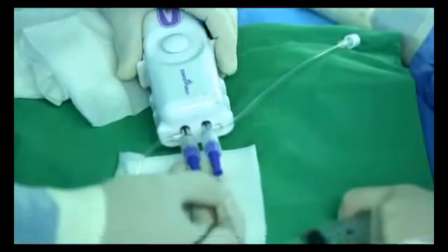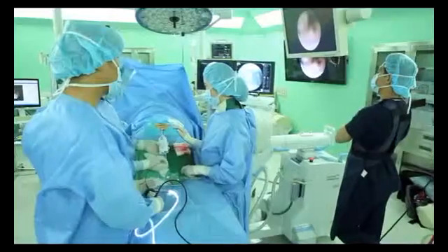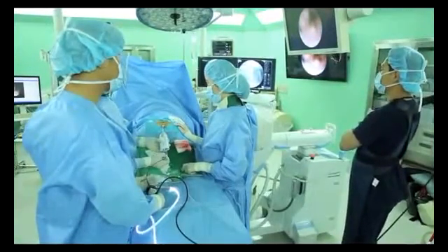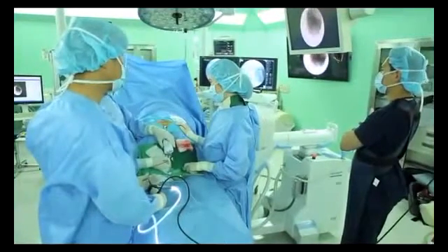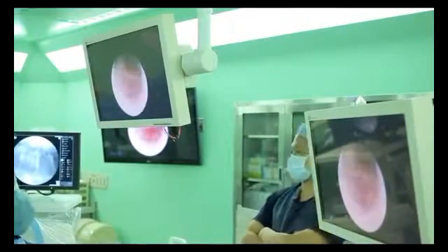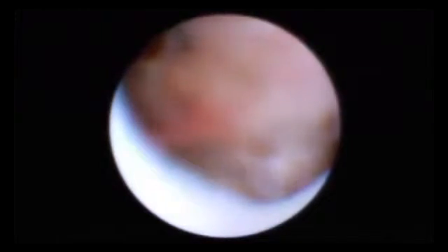You are requested to fire the laser as short as 2 to 3 seconds, and to irrigate the saline intermittently for a clean view, preventing thermal injury to the nerve during the lesioning. Disc particles coming from firing the laser produce a full white view, which may be compared to a blizzard. The more blizzard, the more favorable the prognosis.